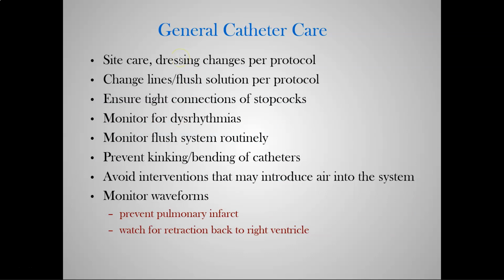Catheter care for any catheter, period. I'll go over that. Site care and dressing changes, absolutely. So once every 7 days is the recommended dressing change interval for any central line. Obviously, we change them PRN for any kind of soiling, a break in the sterility or the sterile field, any kind of tear for any reason, or maybe we were just manipulating the line.